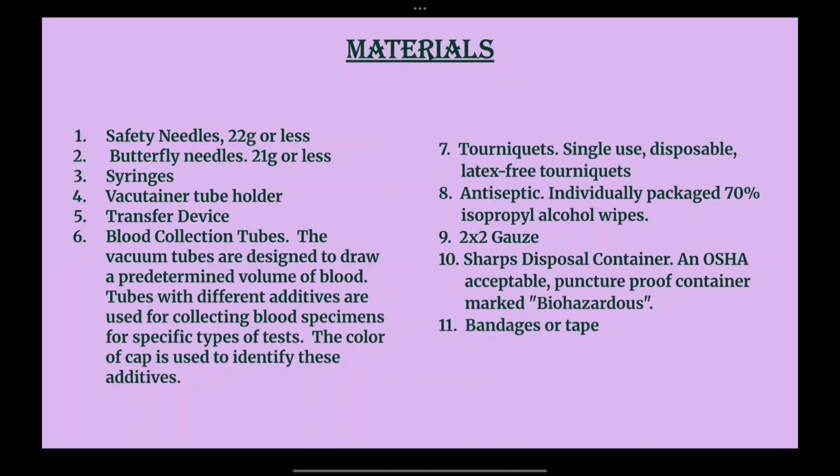Now there are color caps on each of the collecting tubes to identify the type of additive that is used inside it and the type of test that can be performed with the tube. Tourniquets are single use or disposable; both types are available.